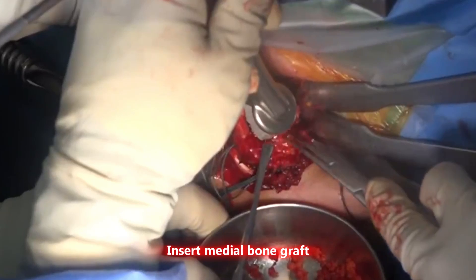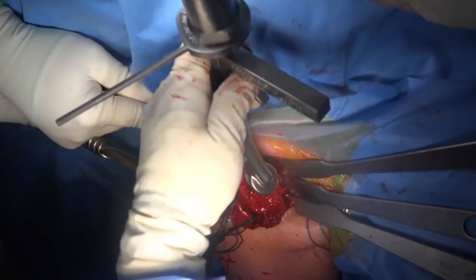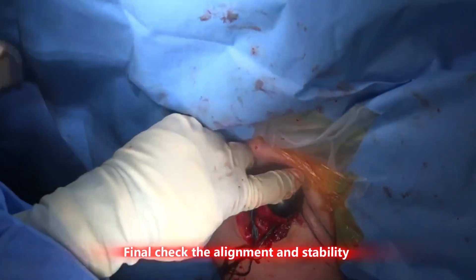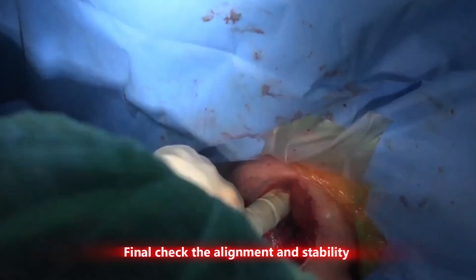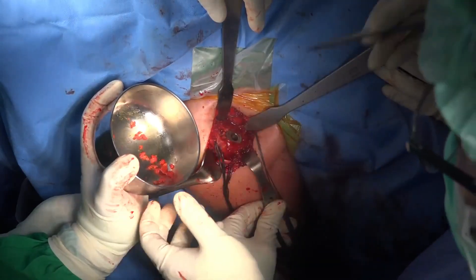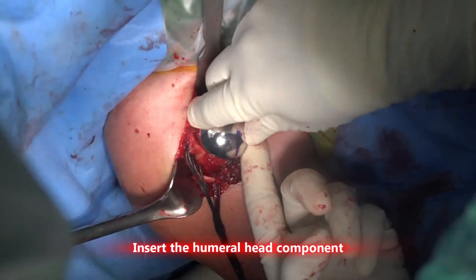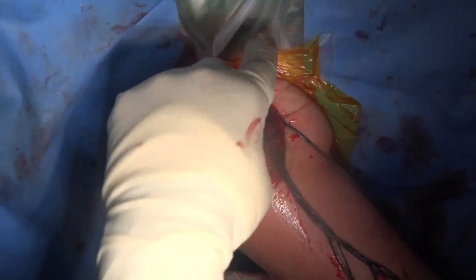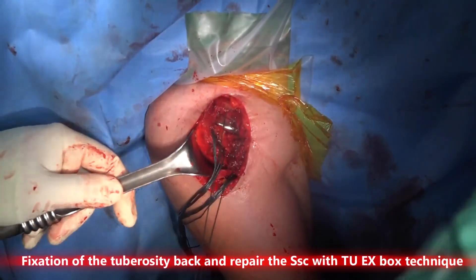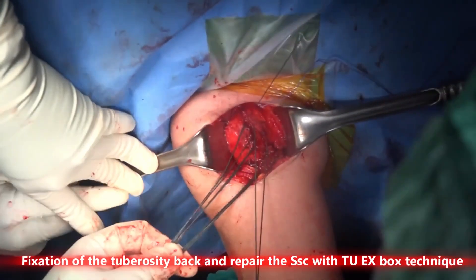Another key to making the stem fit is putting medial bone graft. One of the keys to success in total shoulder replacement is repairing the subscapularis. With this technique, we have not just a horizontal suture, but also an oblique X suture.